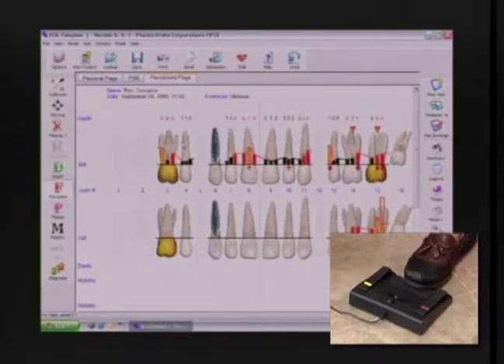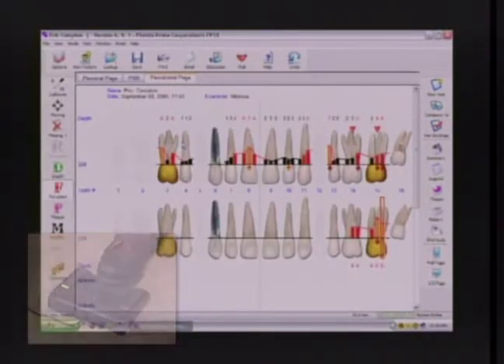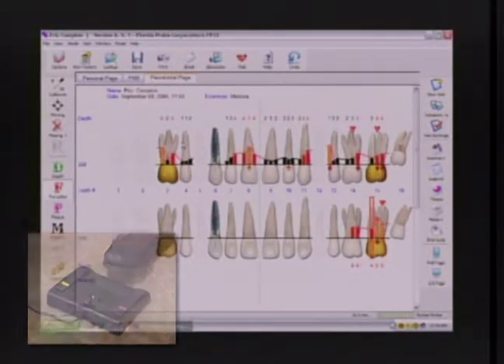1, 1, 2, 3. If I've made a mistake, my undo button still works, to undo the last thing, up to 10 times. Quick taps advance, midline, hold and listen. 1, 2, 3. My moving mode works within furcation mode at this point.